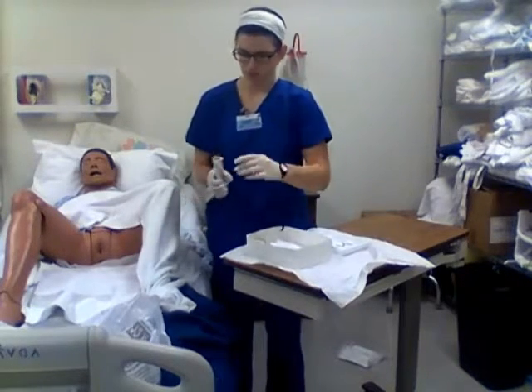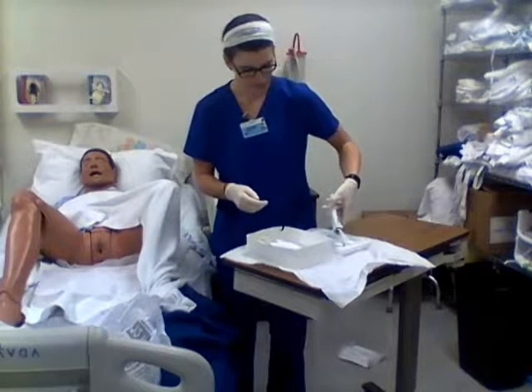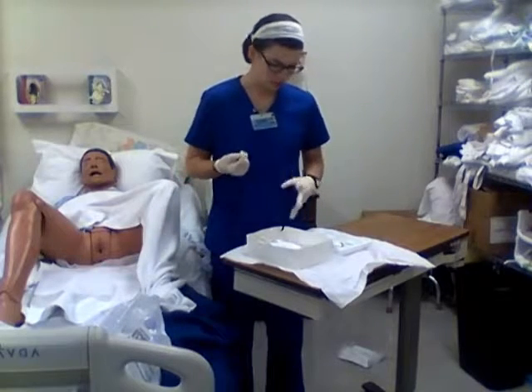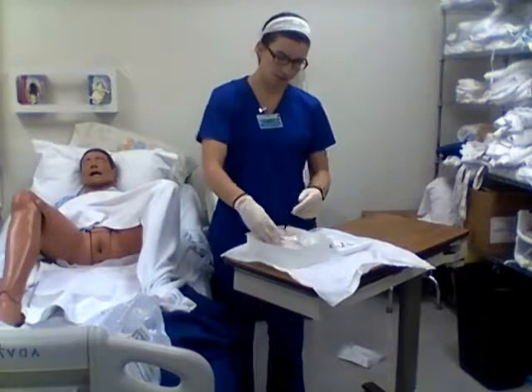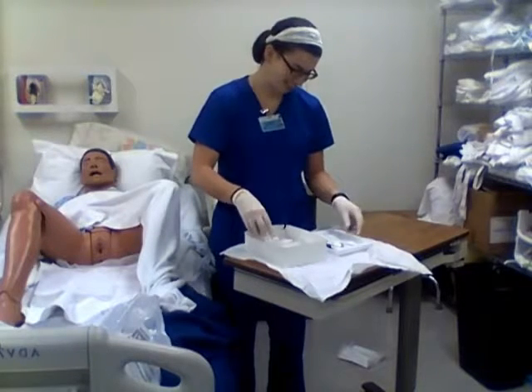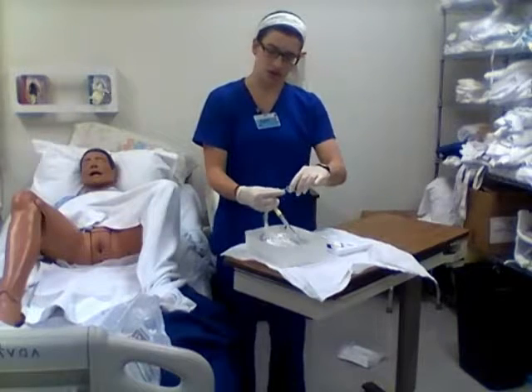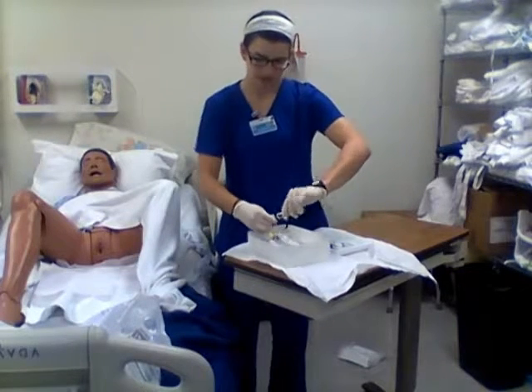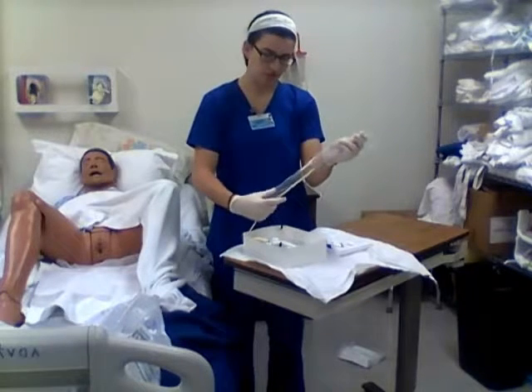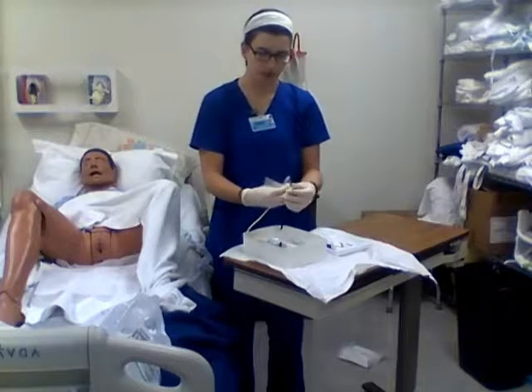All right, so now we can go ahead and we can prep our catheter, which is already prepped for me. All right, so I can go ahead, we can take our saline, we can hook it up to the catheter. We can remove the plastic as long as we're still sterile. And this can also be thrown away.